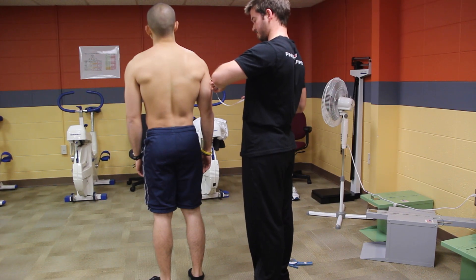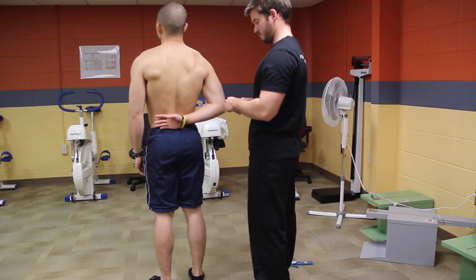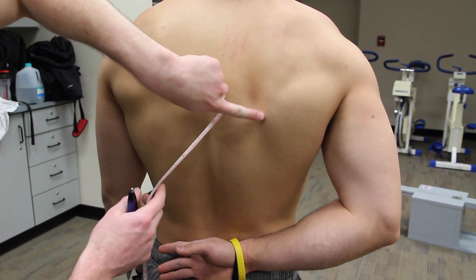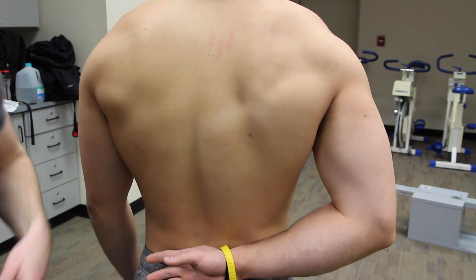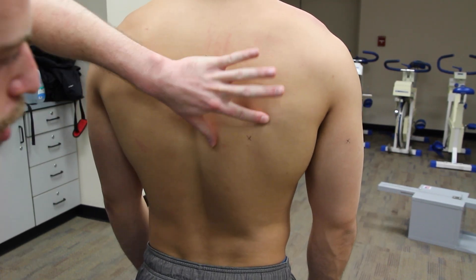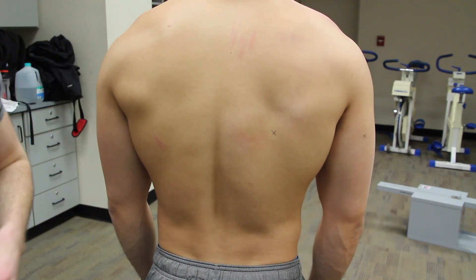Once you've done that, you're going to have your client put their arm behind their back so you can measure the subscapular region. For the subscapular site, make sure the client has their arm behind their back, mark the inferior angle of the scapula, measure two centimeters below and make your X. They can relax their arm to the side. Come in for a diagonal fold, grabbing one centimeter above the site so that you can grab right on, hold for one to two seconds and release.